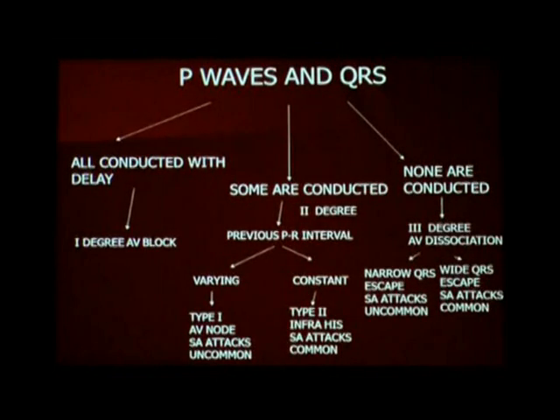Right? Three conditions in adults you must suspect: right coronary disease, sick sinus syndrome, and the earliest sign of digoxin toxicity are the three important causes of sinus arrhythmia in adults. Then you have sinus bradycardia, where all the criteria of sinus rhythm are fulfilled, but the rate is less than 60 per minute.